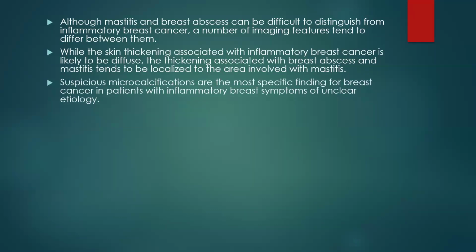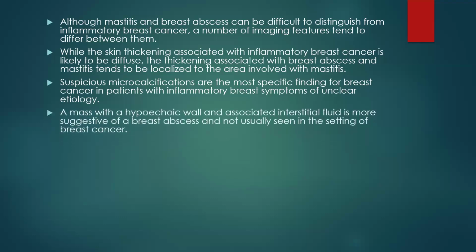Suspicious microcalcifications are the most specific finding of breast cancer in patients with inflammatory breast symptoms of unclear etiology. You won't find that in mastitis and breast abscess. A mass with a hypoechoic wall and associated interstitial fluid is more suggestive of a breast abscess and not usually seen in the setting of cancer.